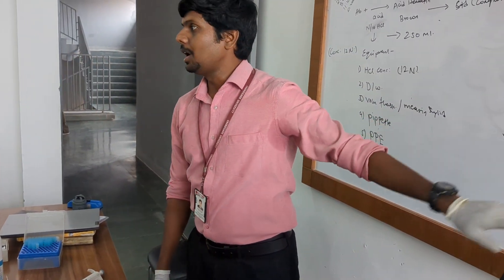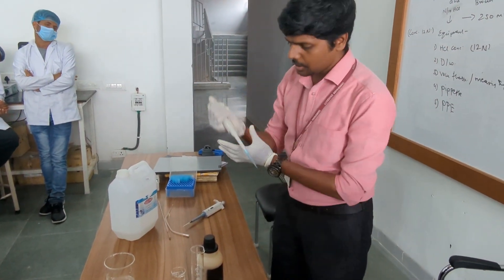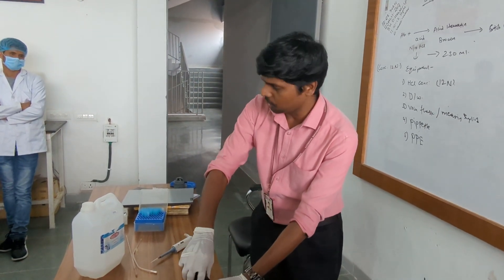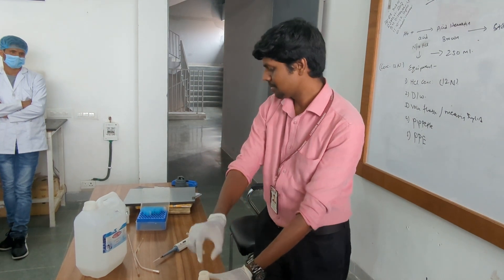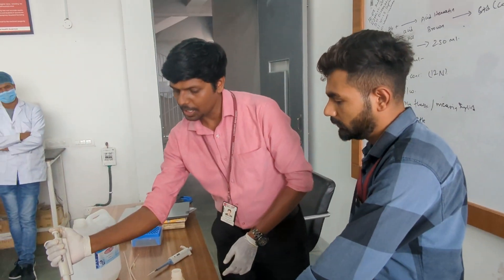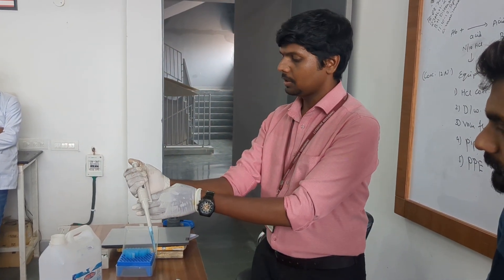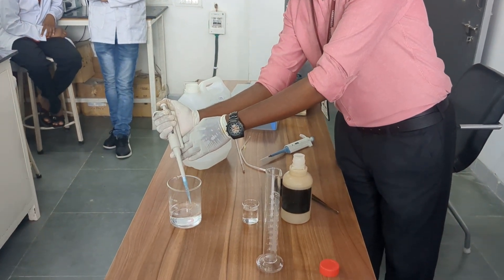Then I am adding 2.08 ml of concentrated HCL. I have already preset 1 ml with the micropipette. Never touch concentrated HCL directly — it is very powerful and will damage your skin. You should wear goggles. It is 2.08 ml total, a very strong acid, so be very cautious. This is 1 ml of HCL.